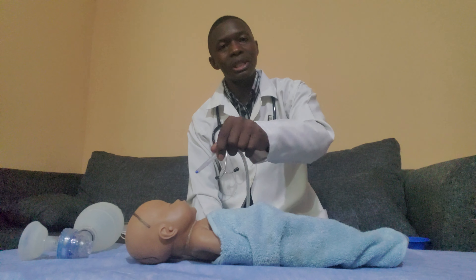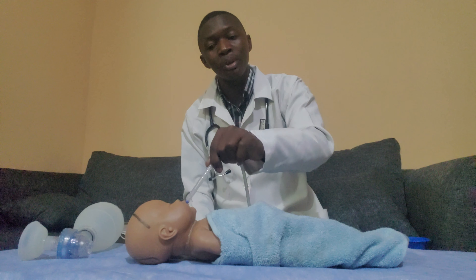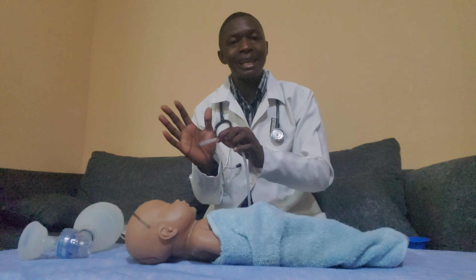Immediately sanitize and don on gloves. Then turn on the suctioning machine and start suctioning by pushing in the suctioning tube starting from the nostrils. You need to clamp the suctioning tube because if you don't clamp it, it is impossible to press it in due to the suction — it will stick to the walls of the epithelium.